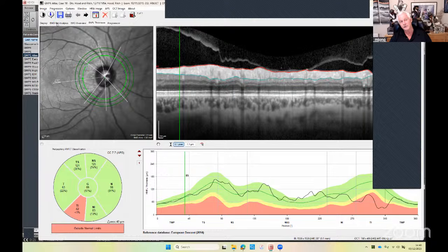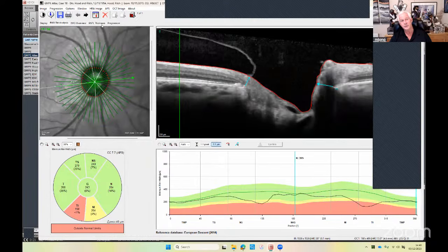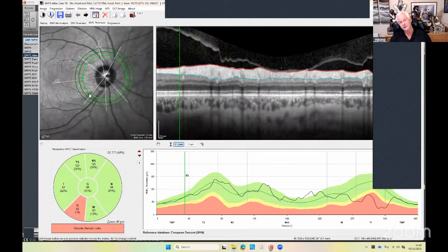And that's consistent with what we've just seen of the neuroretinal rim. And that's consistent with the location where we've seen that focal nerve fiber defect in our fundus image. So unfortunately, for this patient, 2 strikes from my OCT perspective, thinking about glaucoma.